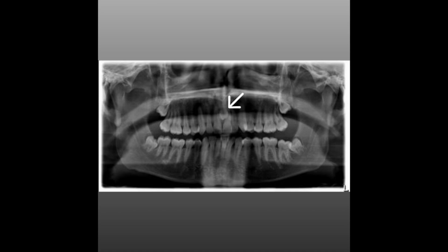Secondly, in case of pathology, if there's a mesiodens, then the mesiodens can be fairly high, in between the roots of the central incisors, or even above the roots of the central incisors. So if you're taking a periapical radiograph, there are chances that you may miss the mesiodens. I remember a few cases where the mesiodens was found fairly high in the palate, near the anterior nasal spine. So it makes more sense to take the panoramic if you suspect hypodontia or if you want to rule out mesiodens or any other pathology.